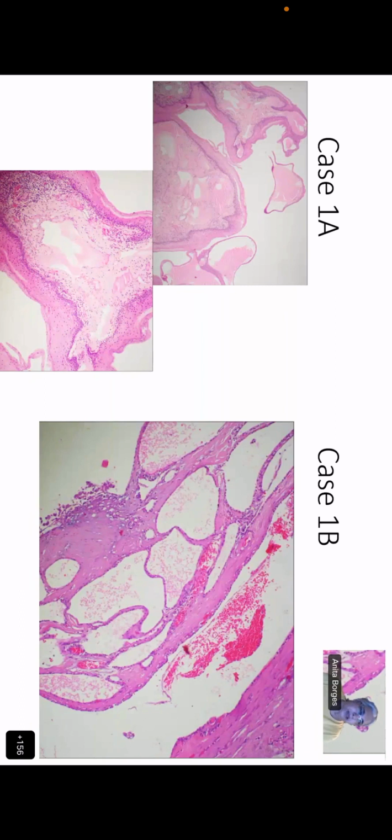Okay. Dia, you know what you said? Can I repeat what you said? You said that there were cystically dilated spaces that contained some pale secretions, right? Yes, ma'am. That there was a mononuclear inflammatory infiltration that was seen. Yes, ma'am. Now let me ask Vimi, you agreed, right? Yes, ma'am. Okay. What about you, Limpy? You agree?